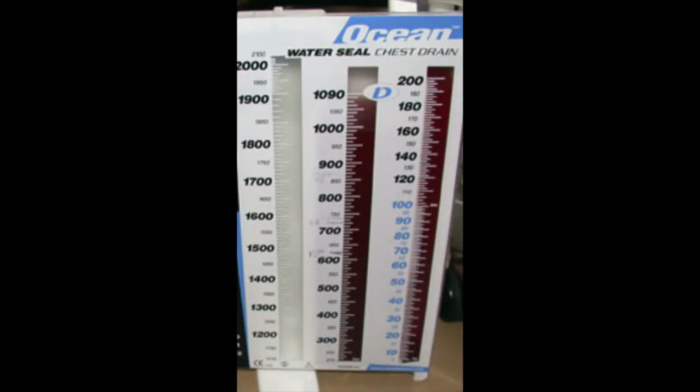So you're also going to monitor the amount of fluid that has drained through the chest drain. Obviously, it's going to start filling from the right-hand side, the smallest demarcations down at the 10, 20, 30, 40 mils. And as it progresses, it's going to head all the way up to 2,000 mils. Now, you also want to make sure you have that spare chamber because as it gets to about 3/4 full, that's the point at which it's maybe warranted that you have to change the Atrium box itself.